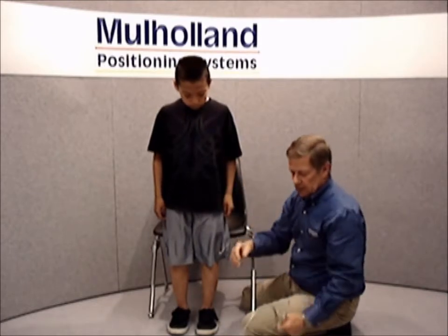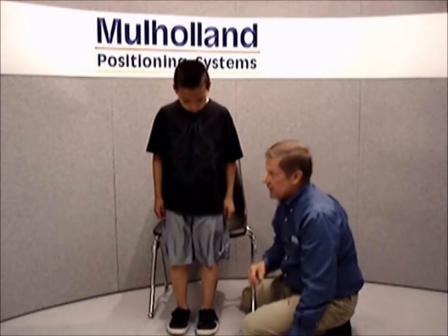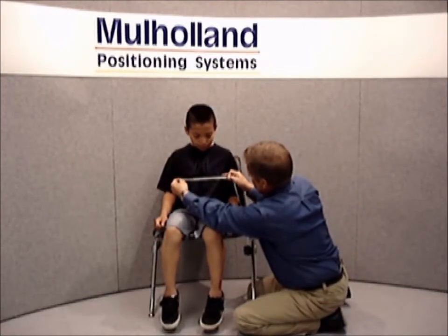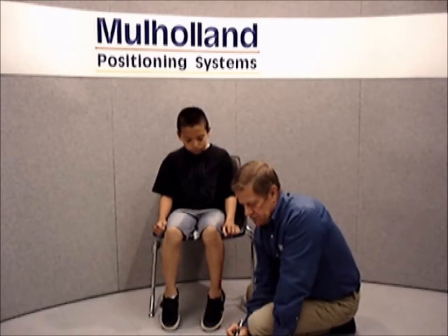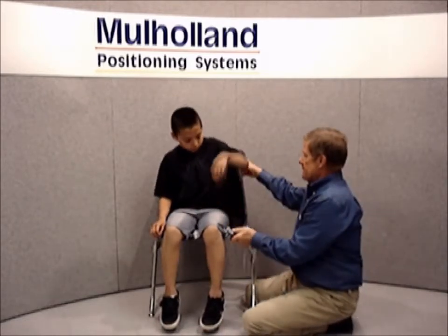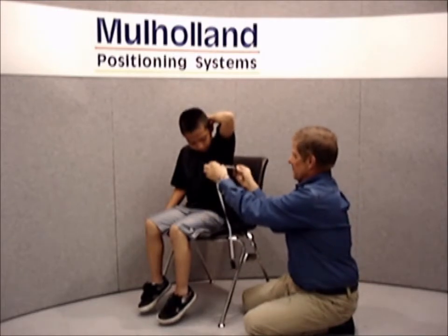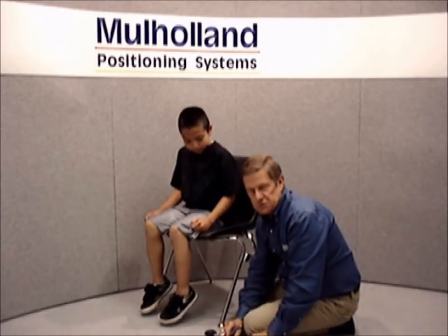Measurement number 2. Deduct 2 inches from your measurement. Measurement number 3 is the chest width. This measurement, add 1 inch to your measurement. Measurement number 4 is chest depth. This measurement, add 2.5 inches.